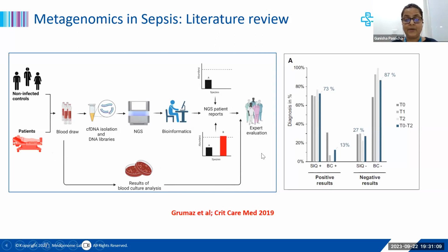Obviously, bioinformatics input and algorithms are needed, and after that, expert evaluation by the clinical microbiologist, the ID specialist, and also the clinician is required in such cases.